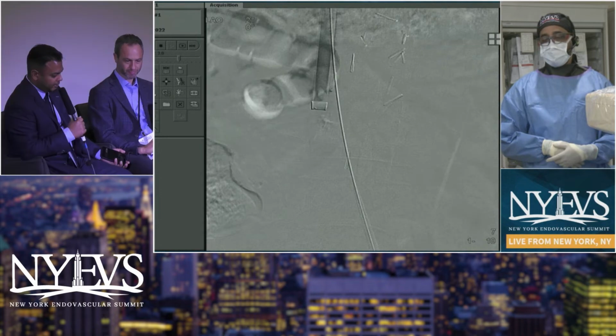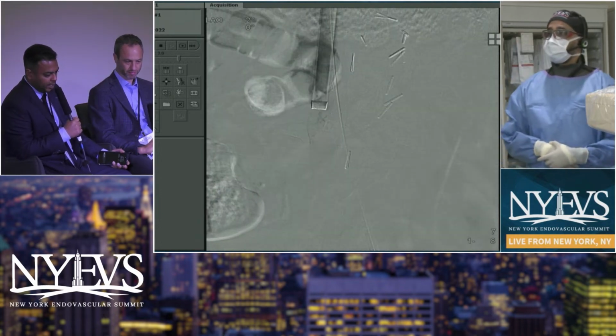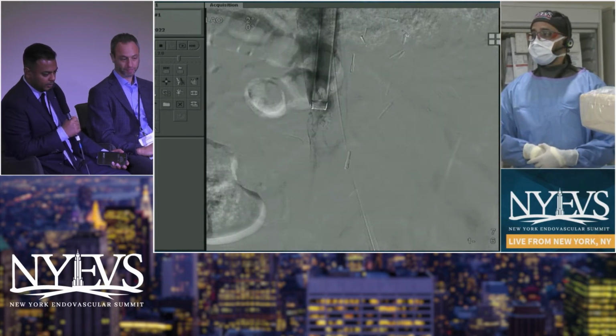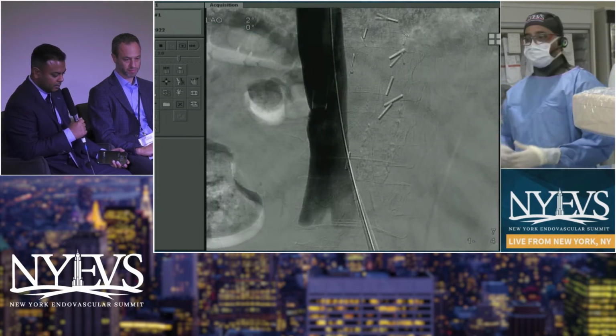So the cavogram looks great here. If you did have, and you fortunately don't, but if you had a contained extravasation or rupture, what would be your go-to tools to have on board? So we actually have the Reliant balloon here somewhere.